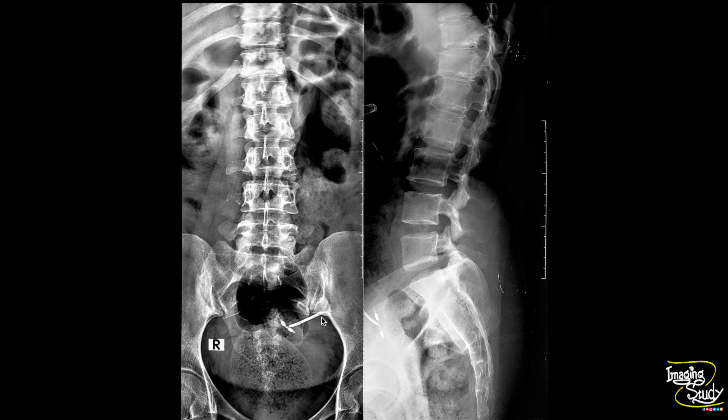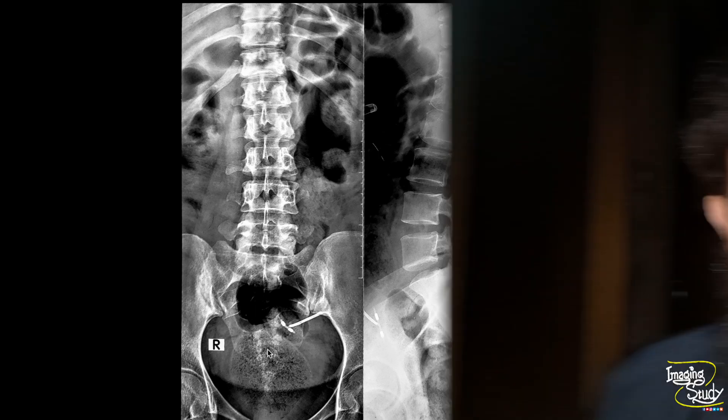Hey everyone, welcome to imaging study. Today we are going to see an interesting case of a twisted or malrotated intrauterine contraceptive device. Recently we got a patient who came for a lumbar spine X-ray. The X-ray showed a displaced intrauterine contraceptive device. When we did ultrasound to search for it, we saw that the device was malrotated — showing an inverted T-shaped appearance. I couldn't record that case, but this week I have got another case of a malrotated intrauterine contraceptive device.